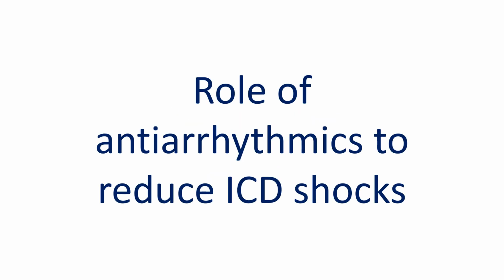The battery life of the ICD depends on the number of shocks it is called upon to deliver and the energy levels needed for each shock. Antiarrhythmic medications can be used to suppress ventricular tachycardia to reduce the potential need for shocks. But there is a caveat. Breakthrough ventricular tachycardia can occur at a lower rate, below the programmed detection rate of the ICD. Recurrent slow ventricular tachycardia can cause tachycardiomyopathy with heart failure in the long run. Antiarrhythmic medications can also sometimes increase the defibrillation threshold, which can be deleterious.